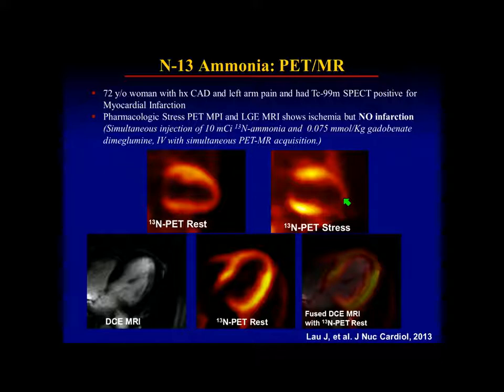The nice thing for us is, as you can imagine, the 10-minute half-life. We're spread out across the campus. Our first medically used cyclotron was installed at Washington University in the 60s. So part of our operation is still in the basement of one hospital. The newer machines are over 2 blocks away from that. And our imaging suites are up on the 10th floor of the building where we have our older cyclotrons. So we have to transport these materials to the site.